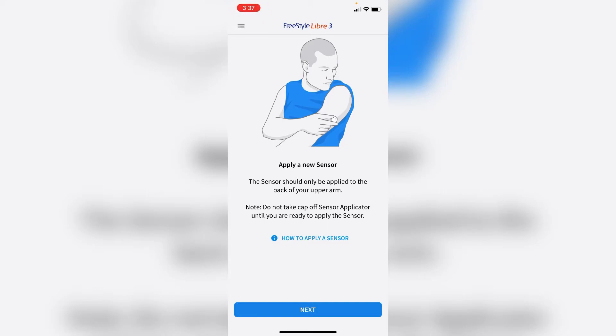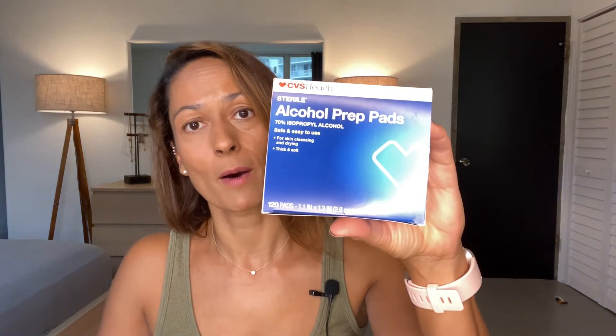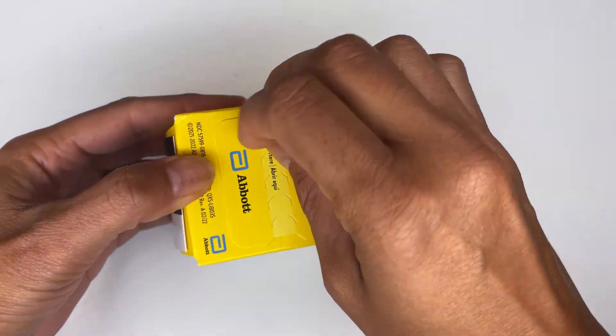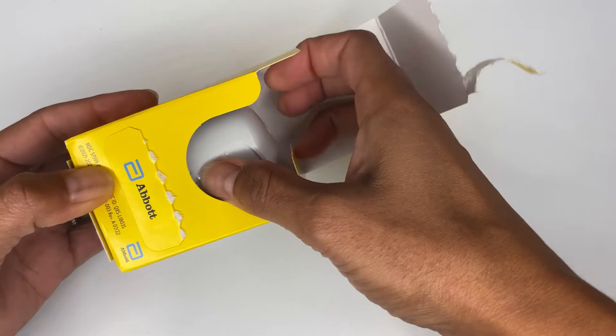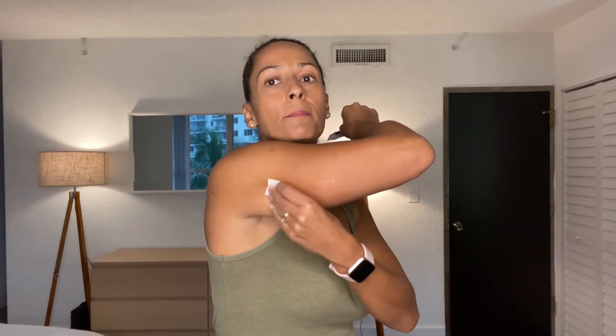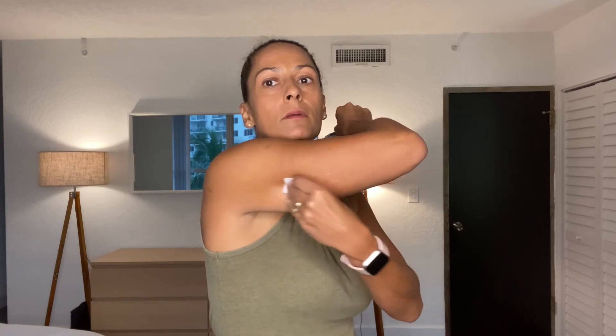Now that we have the app up and running, let's apply the sensor. First, clean your skin with water and soap and let it dry. Once you've done that, wipe down your skin with the alcohol swab. My skin is clean but I also want to use an alcohol swab — that's recommended just to make sure it's completely clean. The sensor is approved for the back of the arm, so that's where we're putting it. Let that air dry.